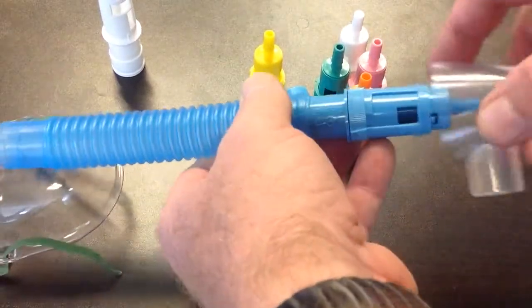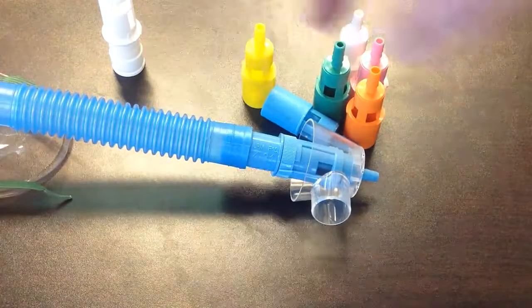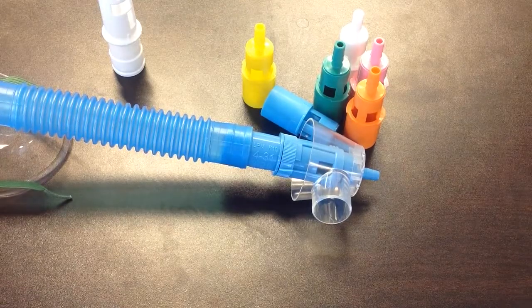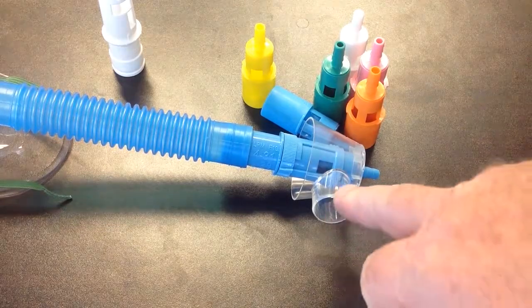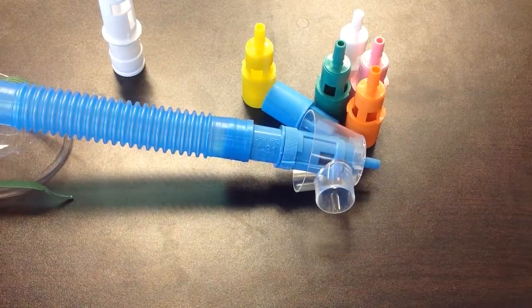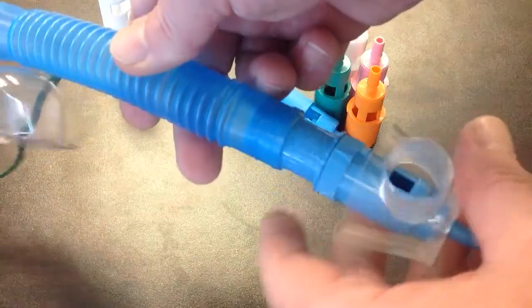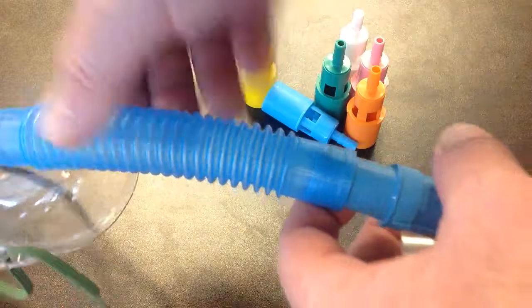For lab checkoffs, you then put the aerosol collar on. In the hospital, you will not see this that much. The true usage of that aerosol collar is in case you want to deliver humidified air. You can hook the corrugated tubing. We'll go over that on the humidification chapter. But then blow in humidified oxygen or humidified air into here to give the patient some extra humidity. I utilize this so the patient's arms and bed sheets do not cover your entrainment ports, thusly giving the patient a higher oxygen delivery than needed.